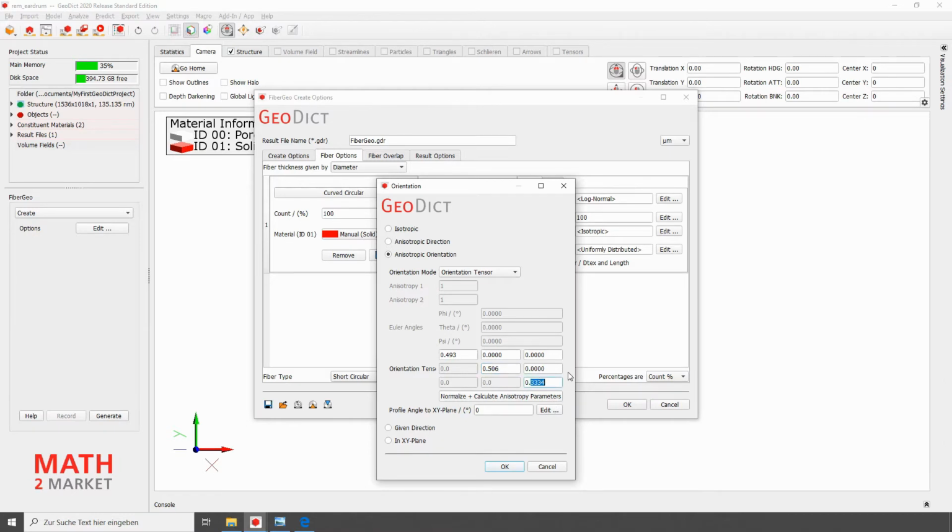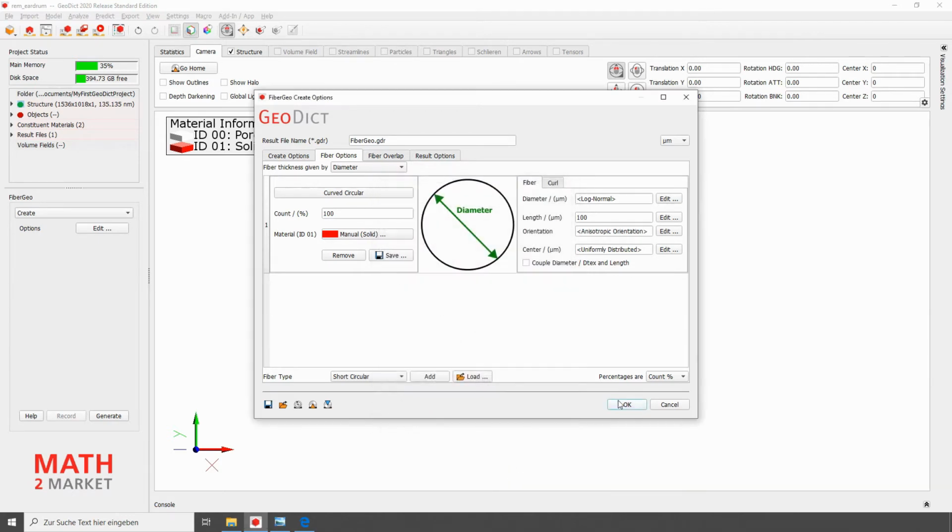In the Z direction, we have no orientation analysis and therefore choose 0 for the time being. Now we click OK. With the parameter center, you can select an inhomogeneous distribution of the fibers in a fiber structure. However, this is not necessary for our example, and we leave it at the default setting.